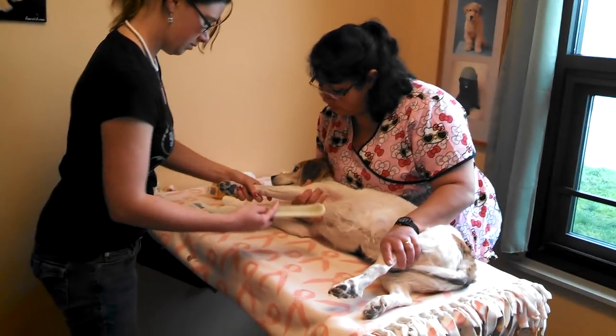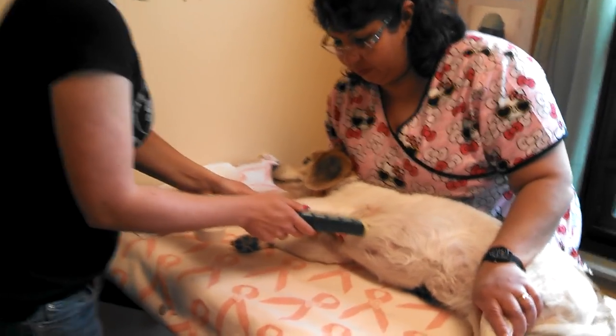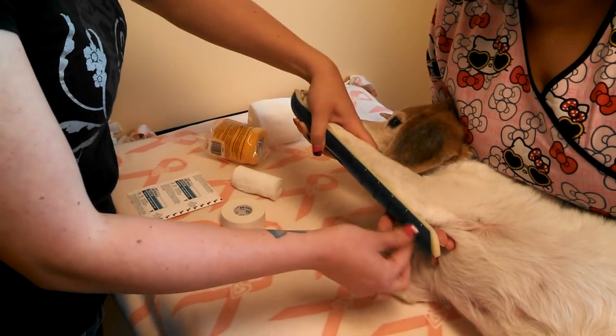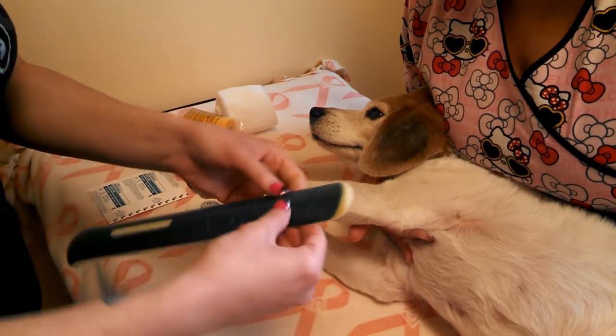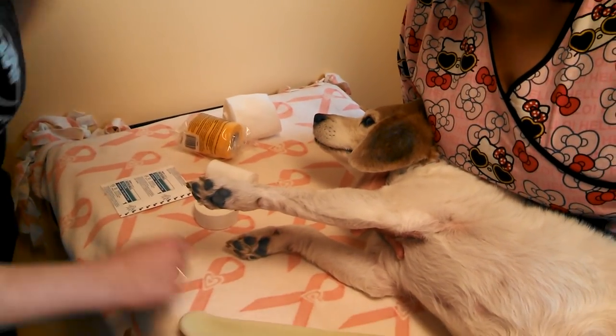So if we weren't pretending, we would cut this spoon splint right here at this line right where the elbow is. We're going to pretend like she's got wounds here. Normally I would break this and I usually pad up the ends of it because these can get sharp.